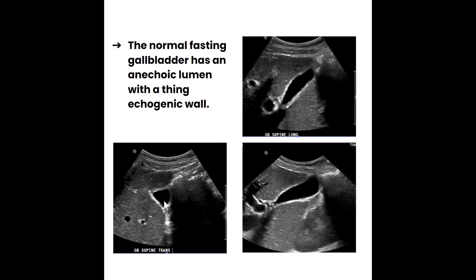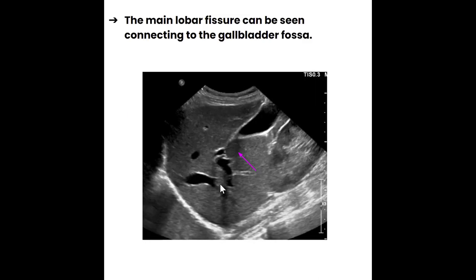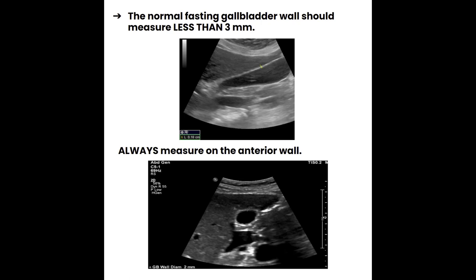In the transverse view, the gallbladder takes on more of a triangular or circular shape, with a nice anechoic center and bright echogenic walls. The main lobar fissure connects to the gallbladder fossa. If the patient had their gallbladder removed, you can identify where it used to sit by finding the main lobar fissure. Ultrasound is an excellent way to measure gallbladder wall thickness and is one of the gold standards for diagnosing cholecystitis.